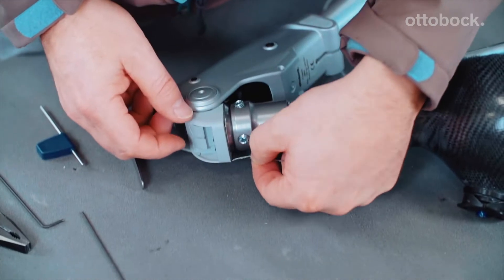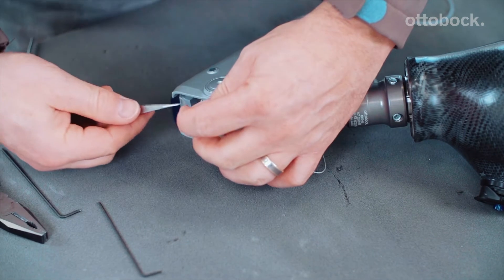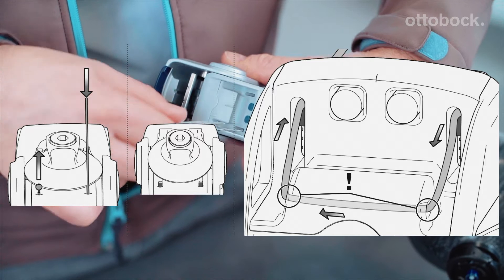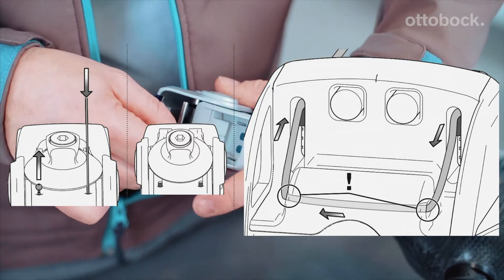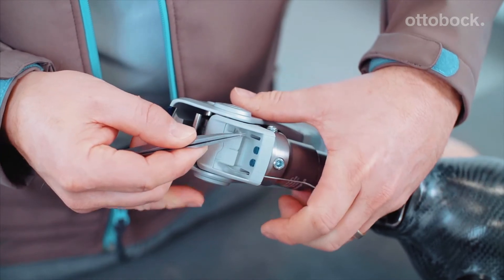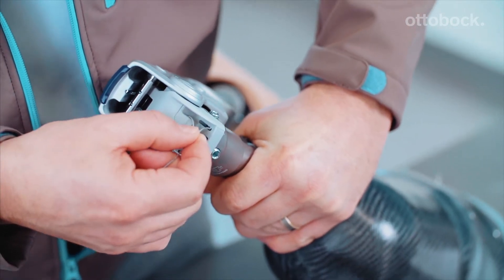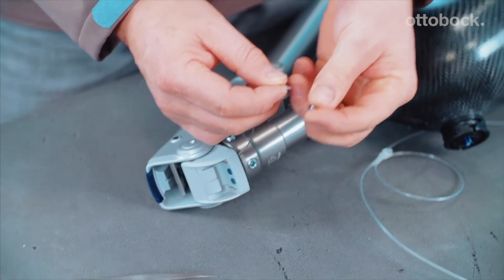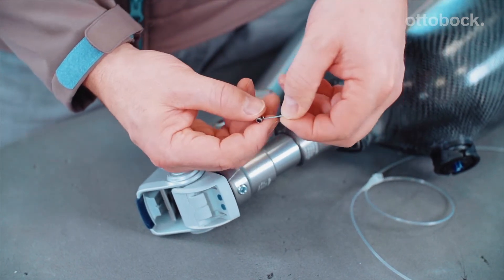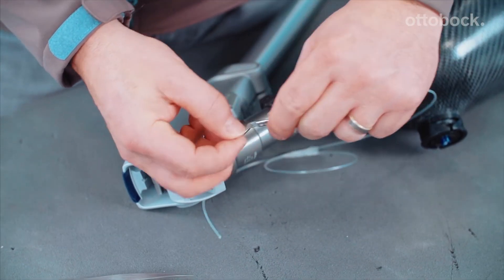Please ensure proper re-threading. We recommend referring to the displayed illustration as a visual guide. The re-threaded lock release cable is then guided through the sleeve, through the loop of the long wire, and then again through the sleeve.